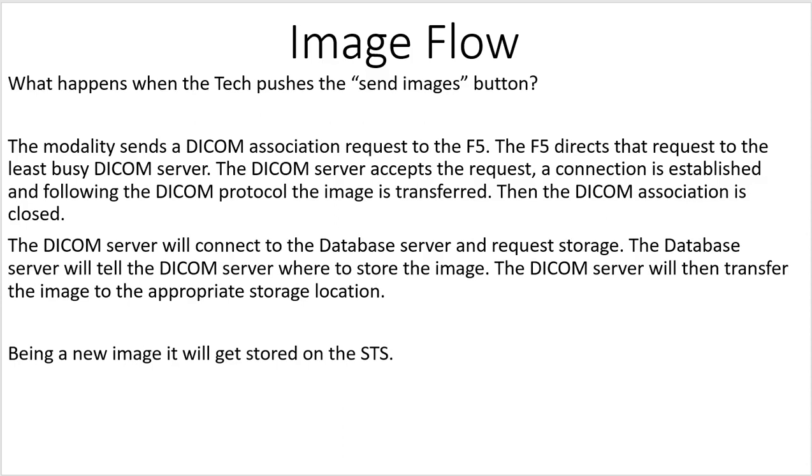The DICOM server will connect to the database server and request storage. The database server will tell the DICOM server where to store the image. The DICOM server will then transfer the image to the appropriate storage location. And being a new image, it will get stored on the STS.